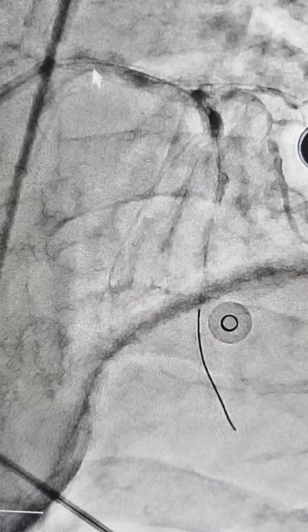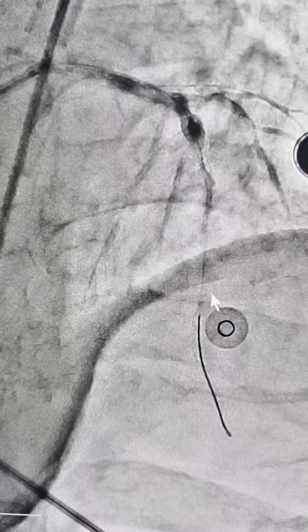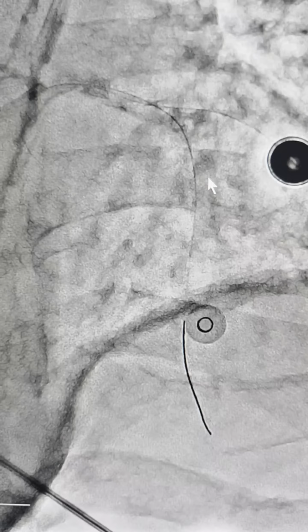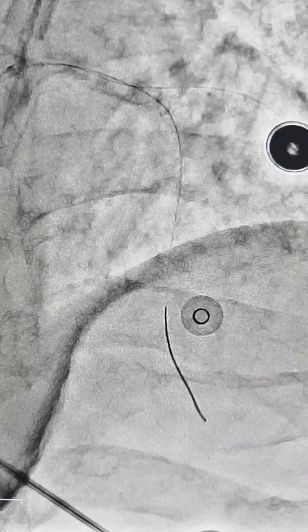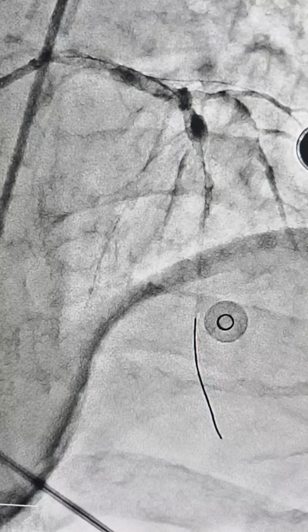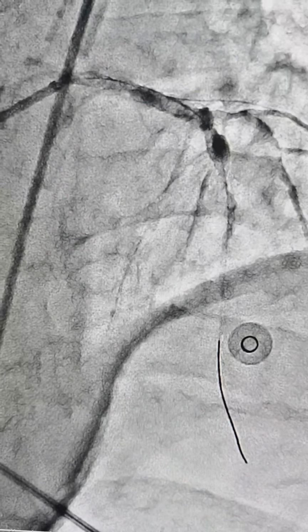The left main looked all right. Don't know what happened here actually. Maybe a thrombus here, but it couldn't have been an occlusion here, which would have caused an anterior MI, not this condition. So we can debate this as much as we like later, but you can see from this that there was still flow down here. This was not a closed vessel, but something had happened here initially.